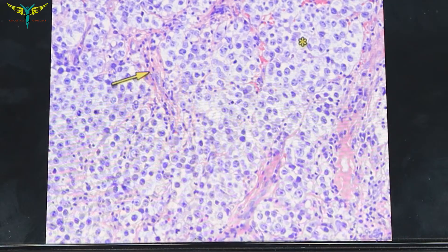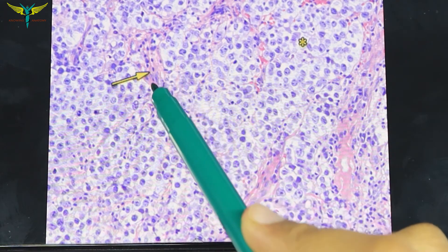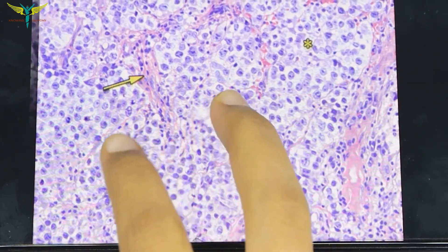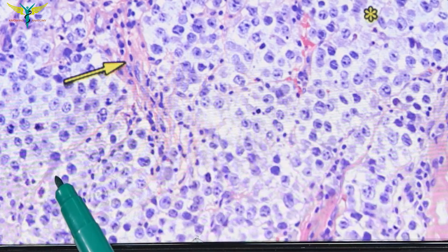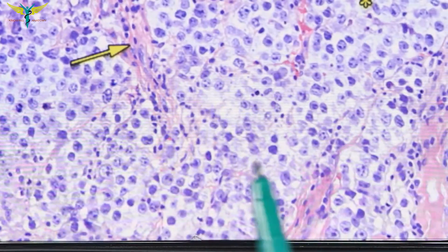This is the real microscopic image of the seminoma. You can note these are the fibrous septas formed by the fibrous tissues, and here these are the testicular cells which are formed in clusters divided by these septas.